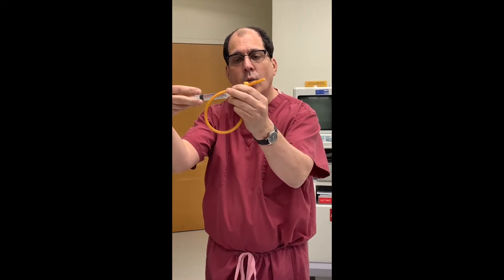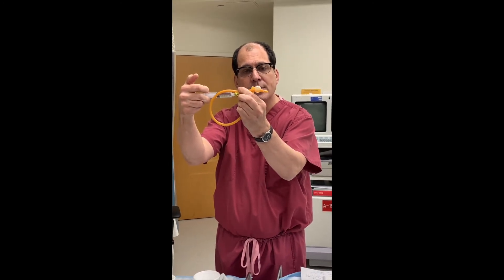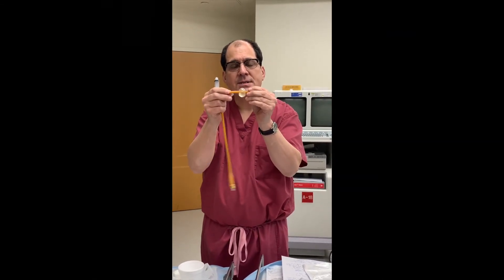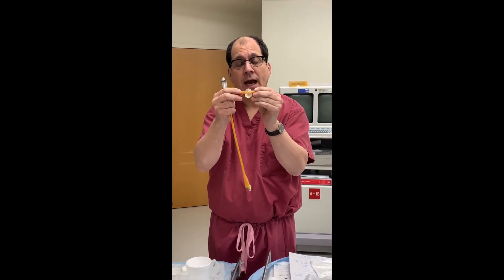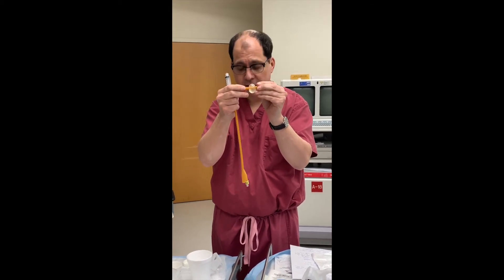You can see the balloon gets bigger. That balloon is what keeps the catheter from falling out. This balloon can also irritate the bladder and make you feel like you have to pee.